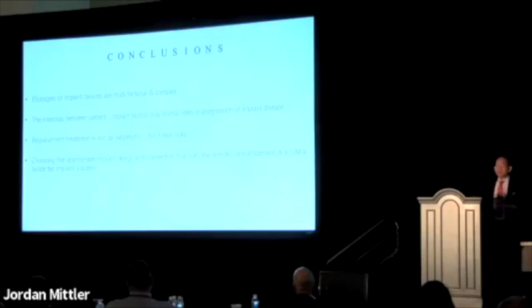So the conclusion: I talked about the perfect implant. Is there such a thing as a perfect implant? It's really the perfect situation and implementing it in the right patient. The etiology of failures and peri-implantitis is multifactorial, and the interplay of the factors I told you about, patient factors, implant factors, and disease progression, plays a pivotal role. Remember that replacement therapy is not as successful. Whatever treatment you do, you have to think 5, 10, 20 years. And choosing an appropriate implant design and connection that suits the specific clinical scenario is a critical factor for implant success.